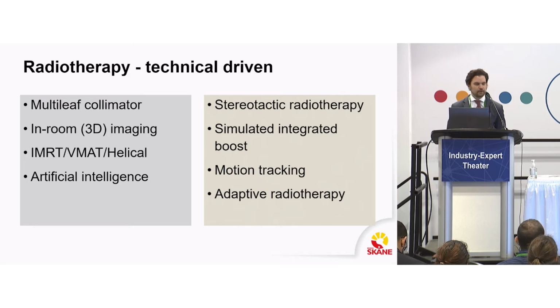Radiotherapy is, of course, a technology-driven treatment modality, and over the decades we've had innovations such as multi-leaf collimator, in-room imaging, intensity modulated radiotherapy, and now artificial intelligence has paved the way for stereotactic radiotherapy, simultaneous integrated boost, motion tracking, and now adaptive radiotherapy.